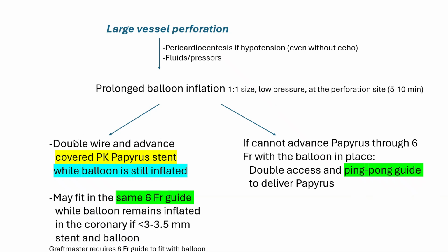Then you do the third step, which you would overwhelmingly need in large vessel perforation, which is advance a covered stent while a balloon is still inflated. And I will detail that a little later.